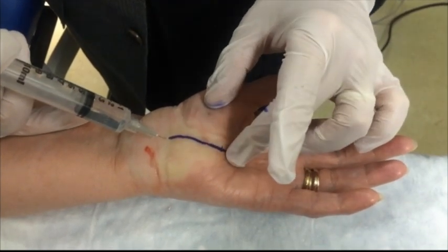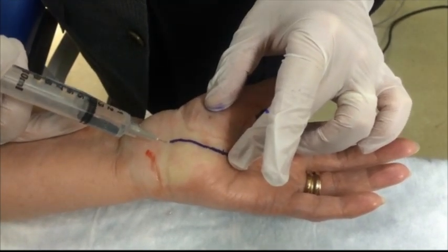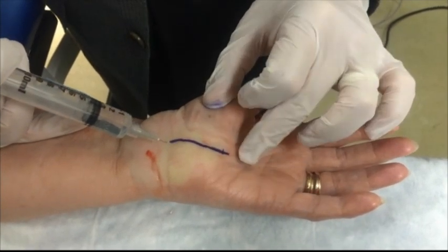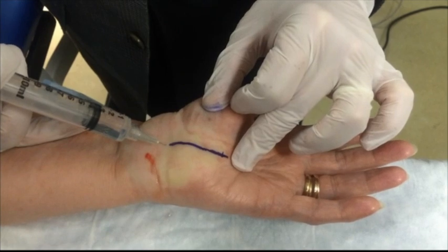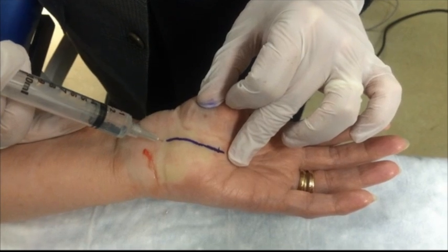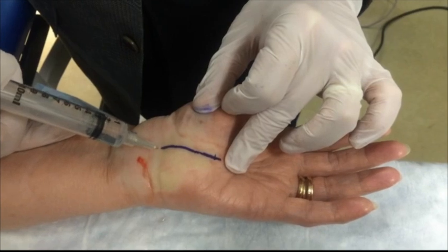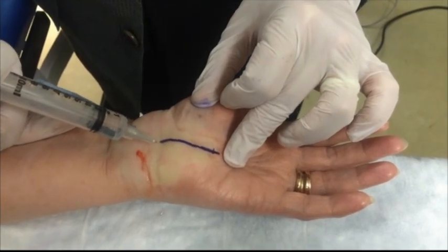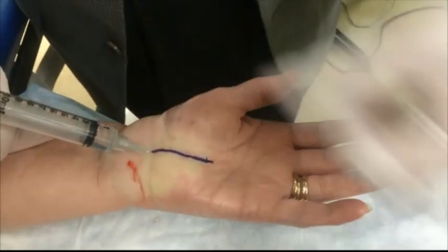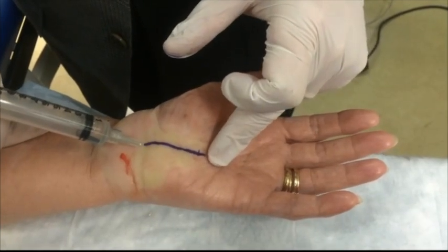Muriel, how many times have you felt pain so far? None. Well, you must have felt the first little pinch. How bad was that? Didn't even notice. Part of the reason is I created sensory noise by pressing on the skin just proximal to where I went in. The second reason is I'm using a 27-gauge needle — I quit using 25-gauge years ago. You can blast it in with a 25, and with that your sharp needle tip is constantly encountering live nerves.